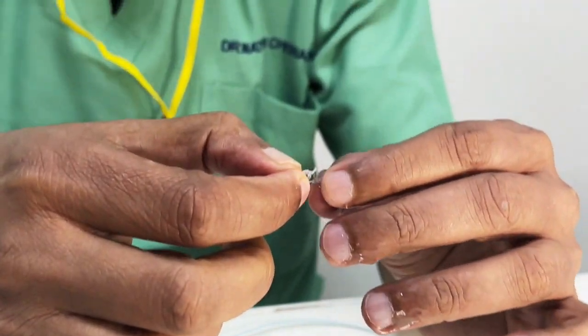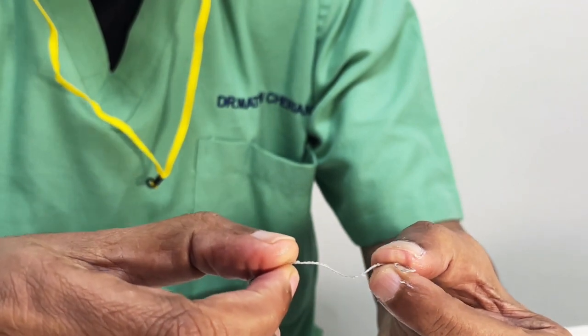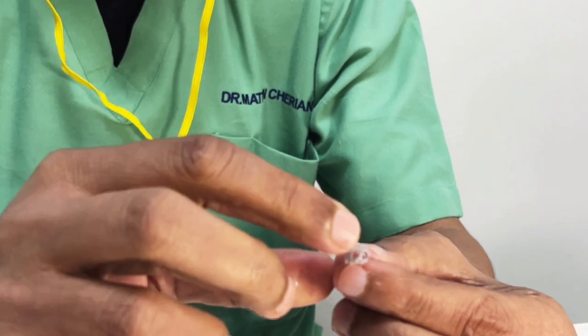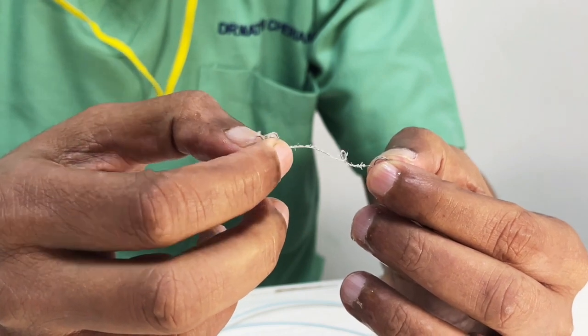So see the construction, very similar, no way different. Same fibrous mesh is there, you can see that here, but much softer. But remember, even these soft coils are not coils for intracranial use. Please do not try to use in an aneurysm.